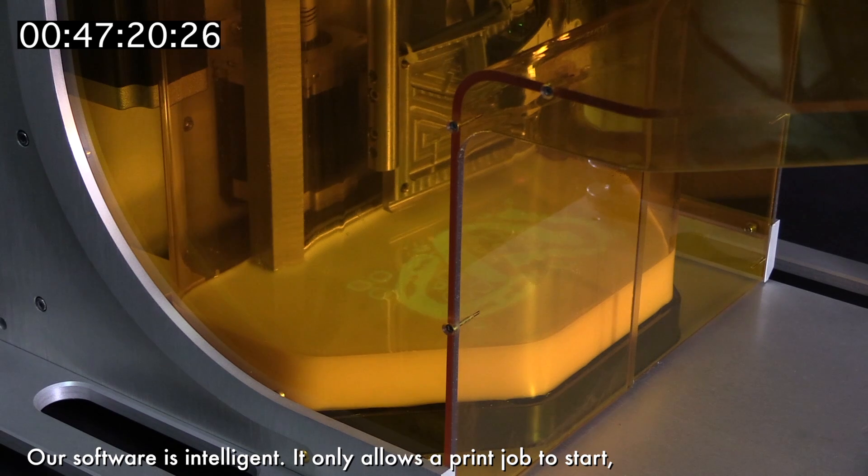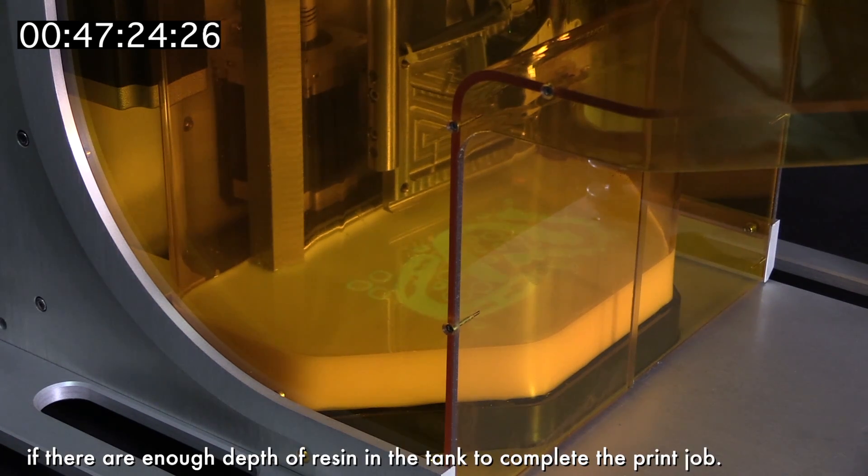Our software is intelligent. It only allows the print job to start if there is enough depth of resin in the tank to complete the print job.